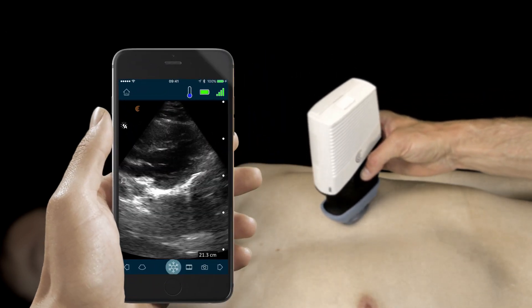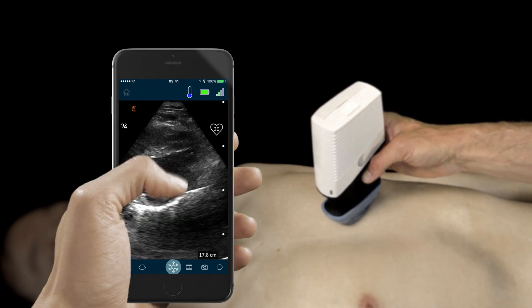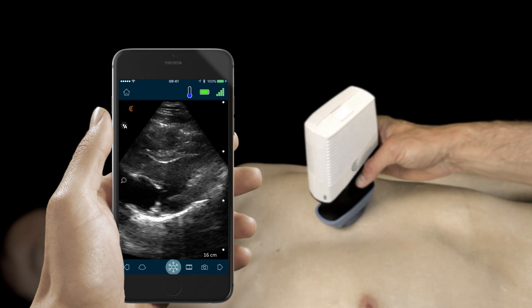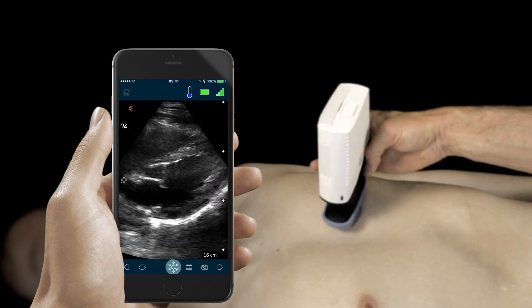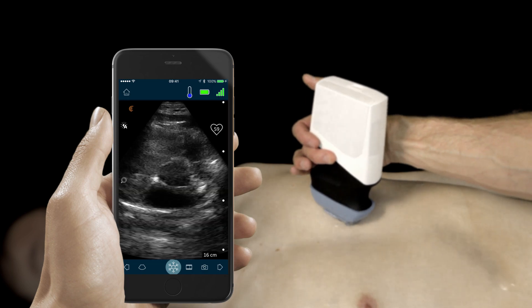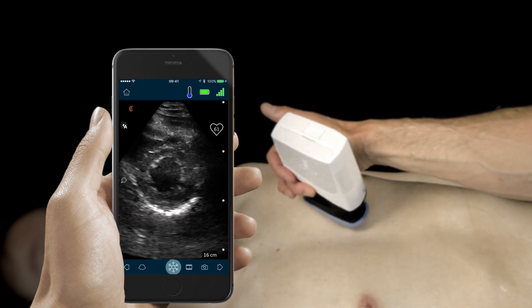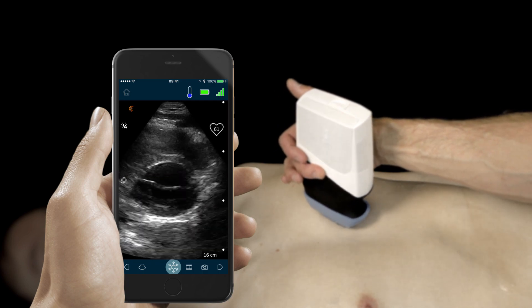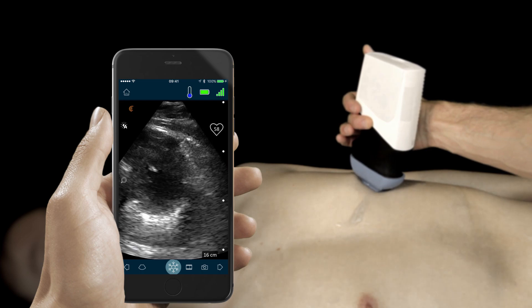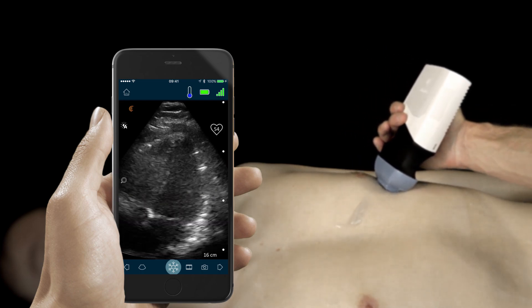To generate our parasternal long axis view, we'll start in the precordium with the scanner indicator pointed towards the patient's right shoulder. From here, we can turn the scanner 90 degrees to generate our parasternal short axis view, fanning through the short axis view, and finally sliding the scanner towards the apex to generate our apical four-chamber view.